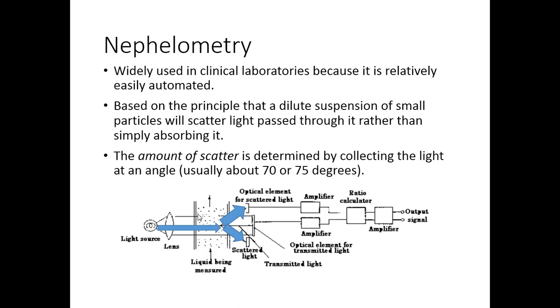Nephelometry is very, very similar to turbidimetric testing. It's easily automated now. It's really easy to do. And instead of being based on the principle of light transmission through a cloudy solution, or a well-mixed solution of presumably some antigen-antibody complexes, what happens when the light hits the particles? I told you: the light, as it hits a particle, gets scattered off to the side. Only the light that doesn't hit passes through for turbidimetric testing.